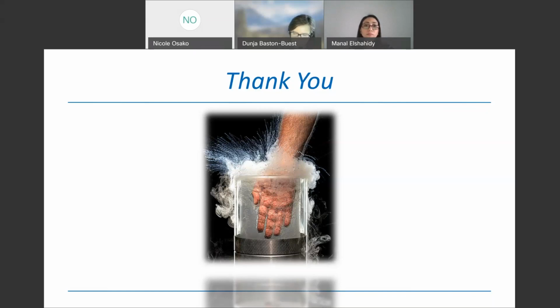Or if you have enough or supernumerary containers in your center, you can change between the tanks, or have one spare tank. It's advisable to do that at the start. And some also use sterilized liquid nitrogen.